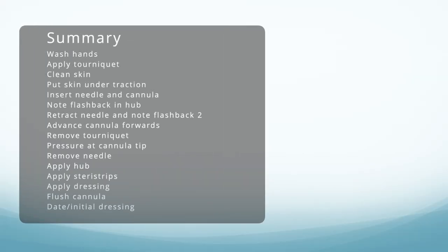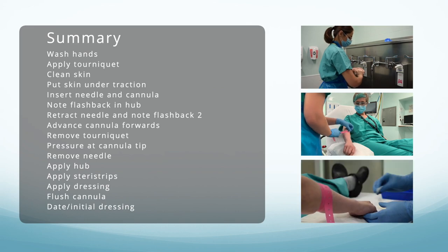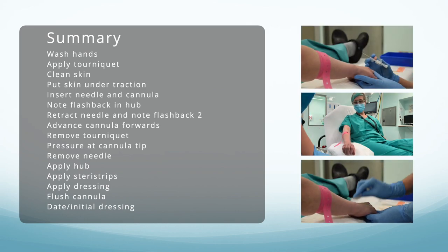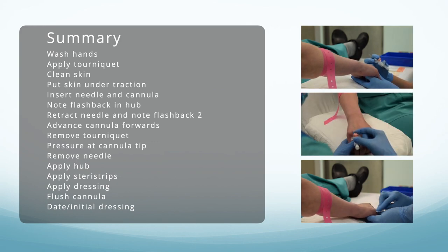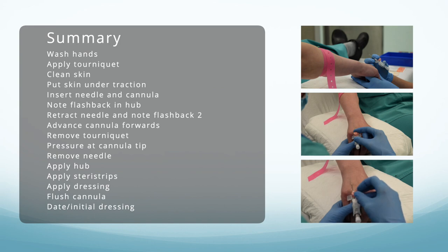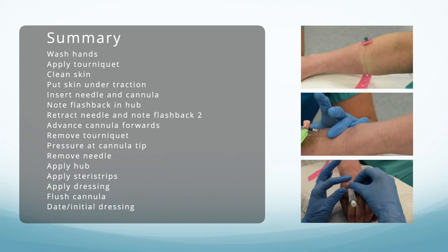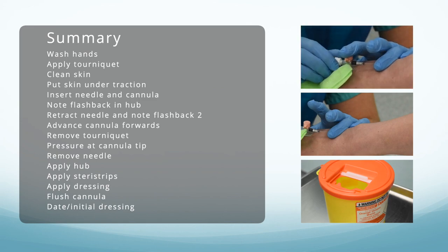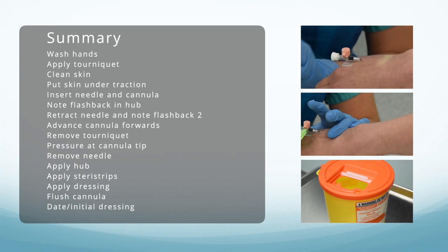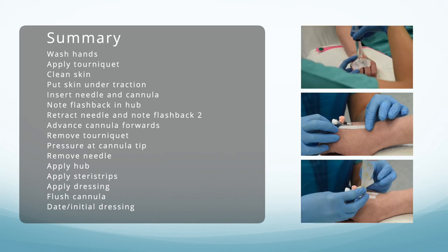Step by step: wash your hands, apply the tourniquet and identify the site, clean the skin thoroughly, hold the skin taut, insert the needle and cannula tip until first flashback, retract the needle to see second flashback, advance the plastic cannula, remove the tourniquet, apply pressure at the tip, remove the needle and discard the sharp safely. Apply the hub or bionector, put sterile strips across the wings, apply the dressing, flush the Venflon, and apply the labelling.